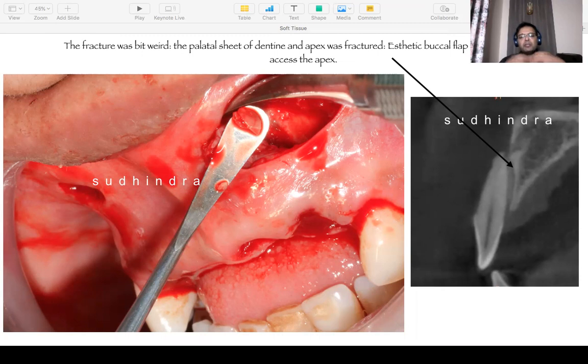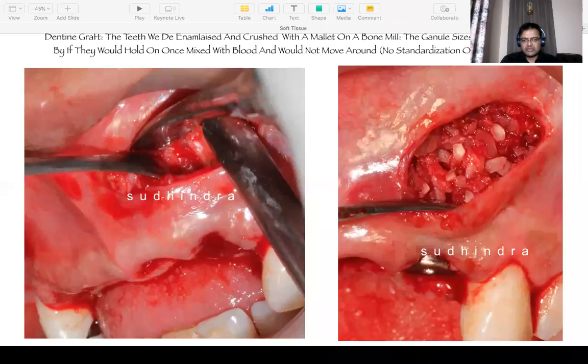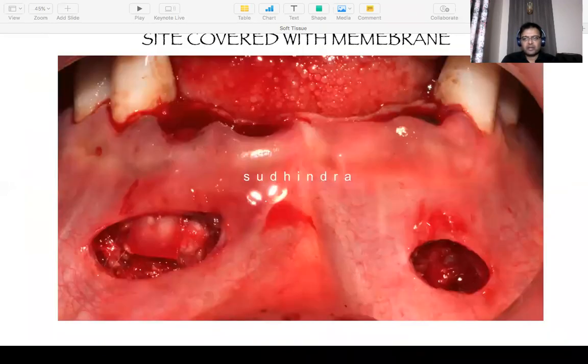Do not try and make a big envelope from the crest, open the whole curtain and try and remove the root. No, you can just make a small incision in the vestibule, and then you can literally tap it down. The root that is fractured, you just tap it down. So you do what we call an aesthetic buccal flap. So this palatal sheet of root that was remaining was opened through that incision. The same piece of tooth was then crushed down and made into autogenous dentin bone graft. The implant went in, the dentin graft went in, then the membrane to cover the graft.